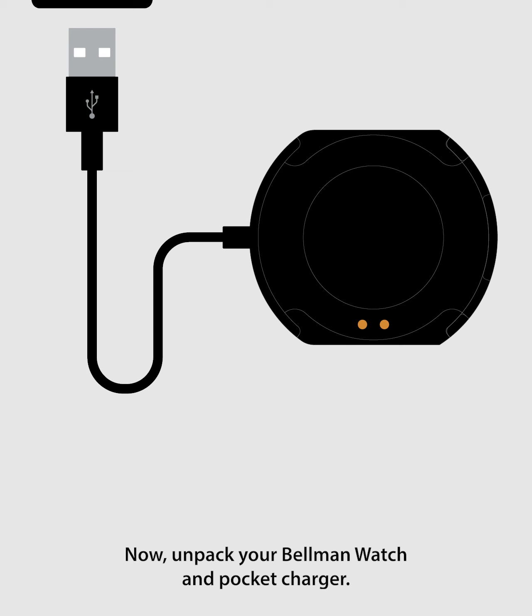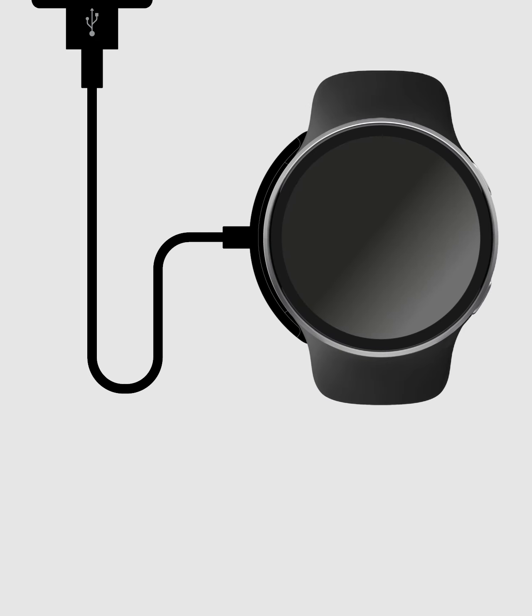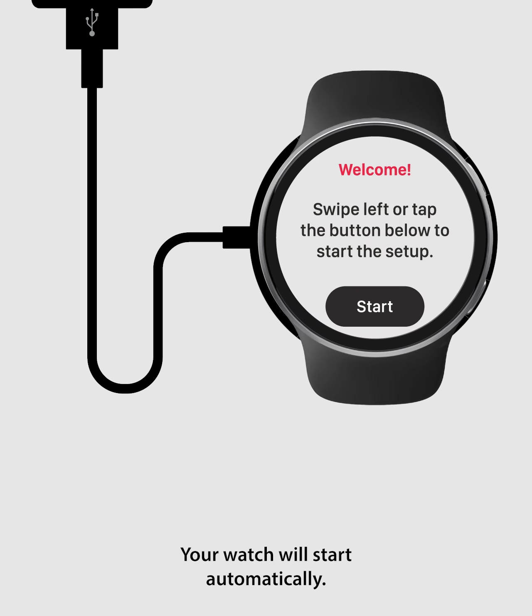Unpack your Bellman watch and pocket charger. Then connect the charging cable to a USB power adapter or a USB computer port. Attach your watch to the charging dock, making sure that the charging terminals align. Your watch will start automatically. Tap start on the watch screen to make it ready for pairing.